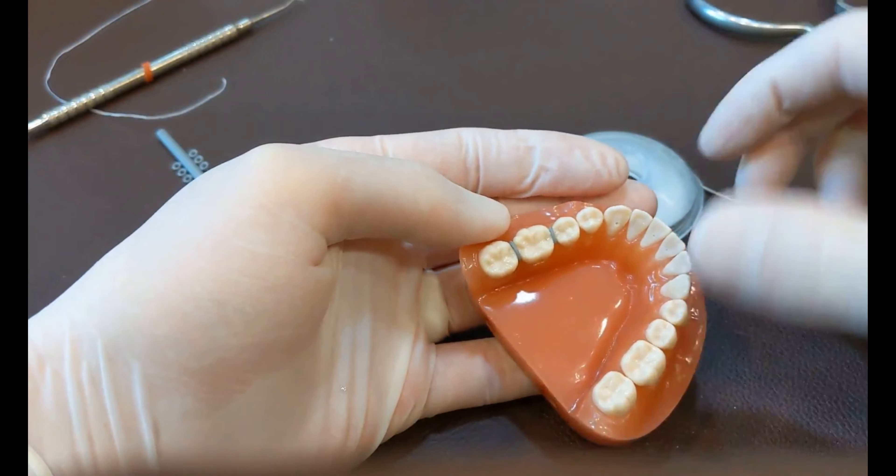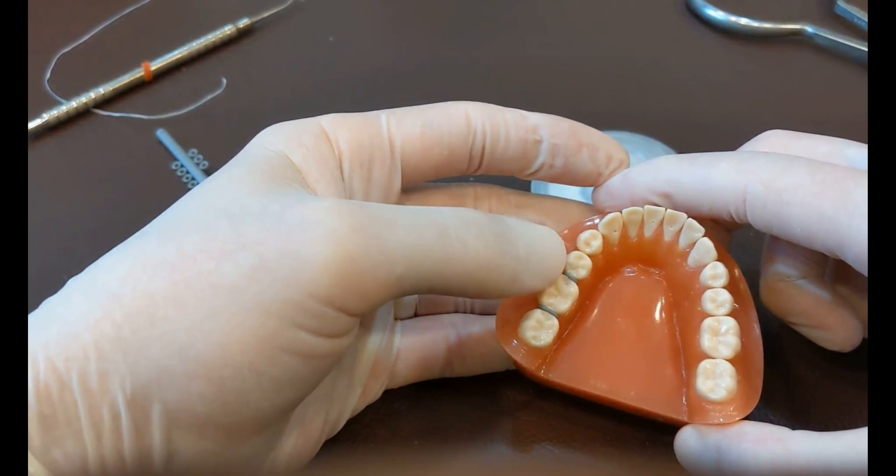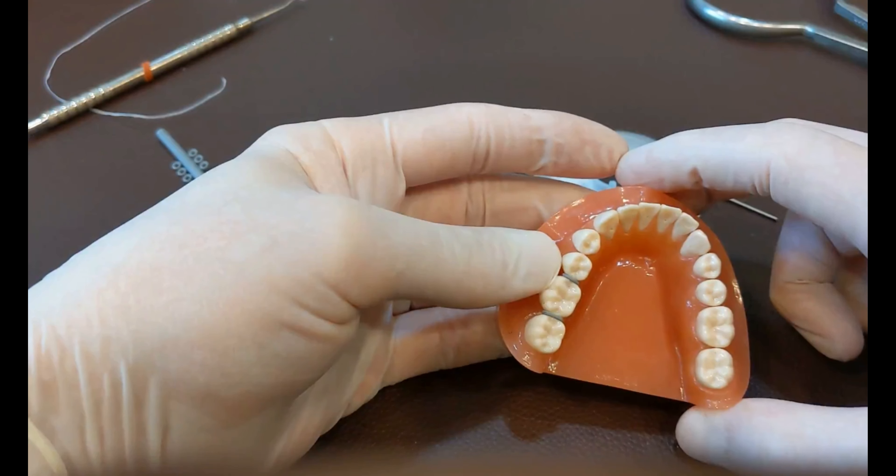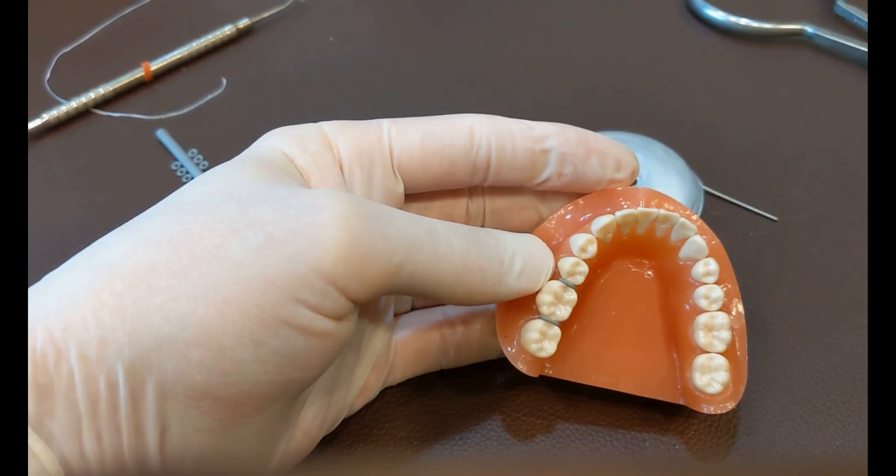And then warn the patient that the teeth are going to be a little bit tender, that's normal, so they're not concerned when the teeth are going to be a little bit sore that night and the next day.